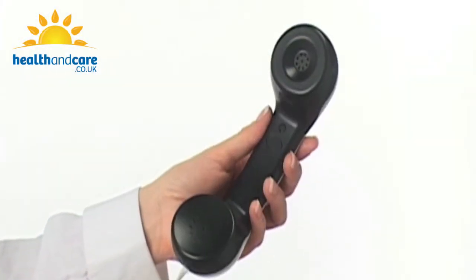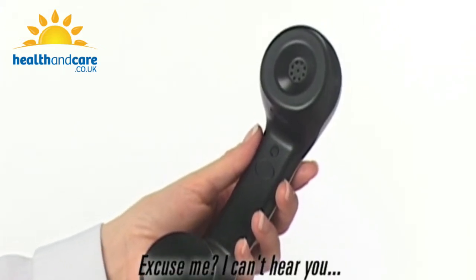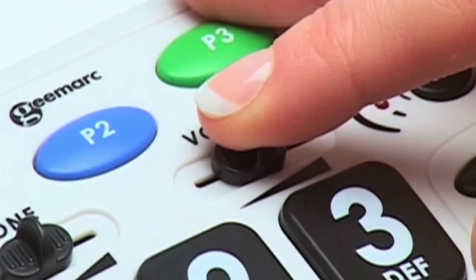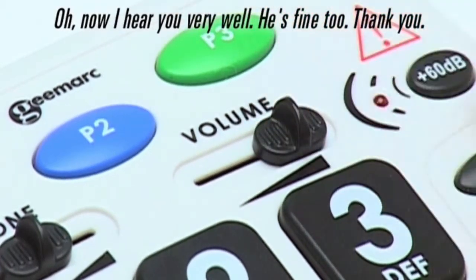Hi Grandma, how are you? Hi darling, I'm fine. And you? I'm good, thank you. How's Grandpa? Excuse me? I can't hear you. How's Grandpa? Oh, now I hear you very well. He's fine too, thank you.